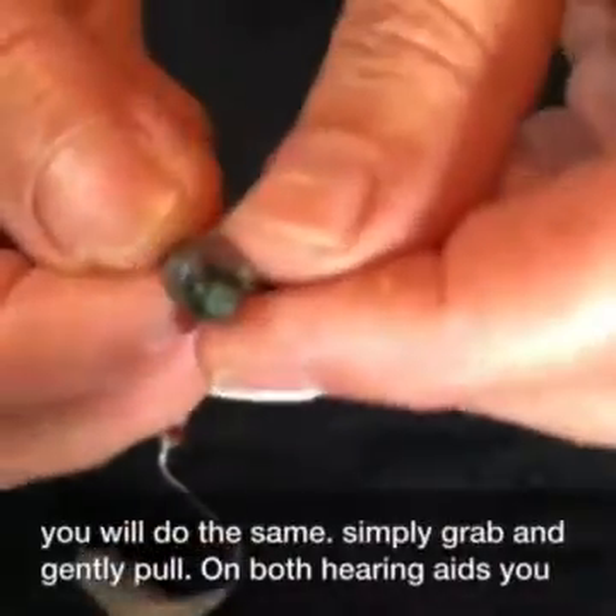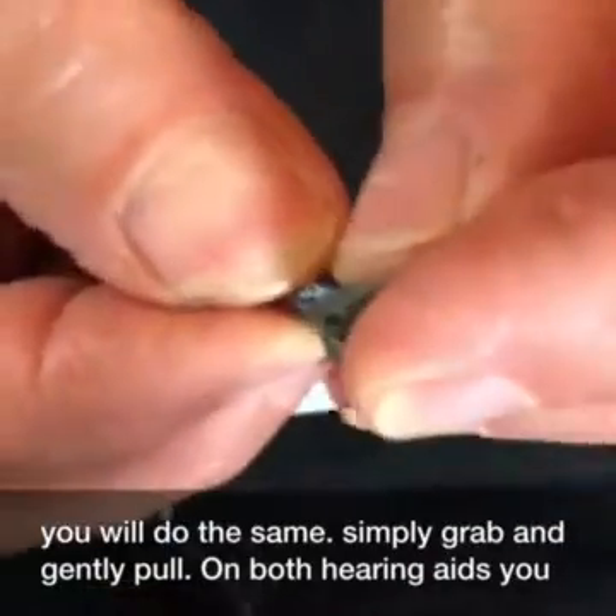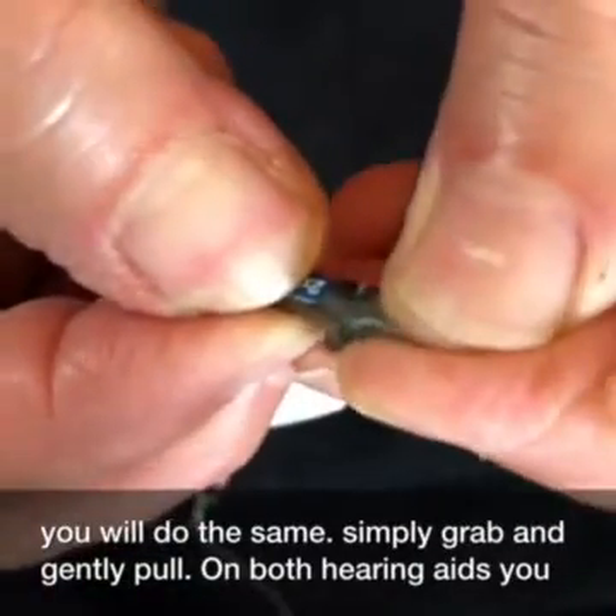On this style hearing aid, it is a softer dome. You will do the same — simply grab and gently pull.